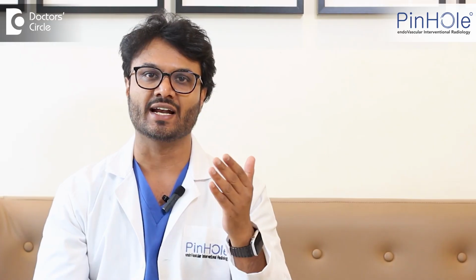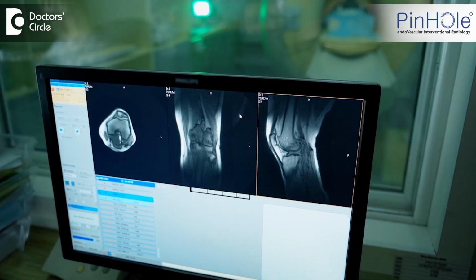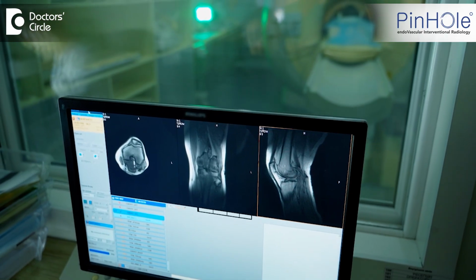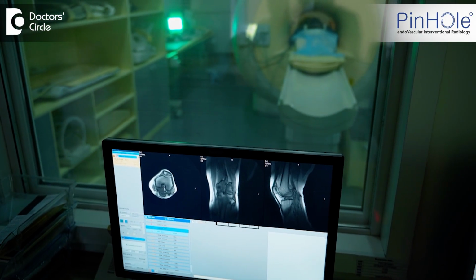Now, in a broad heading, we call it image guided biopsy for ultrasound and CT guided biopsy, wherein we can see the organ or the target lesion, may it be cancer or non-cancerous lesion, which we have to biopsy. In this procedure, it is very simple.